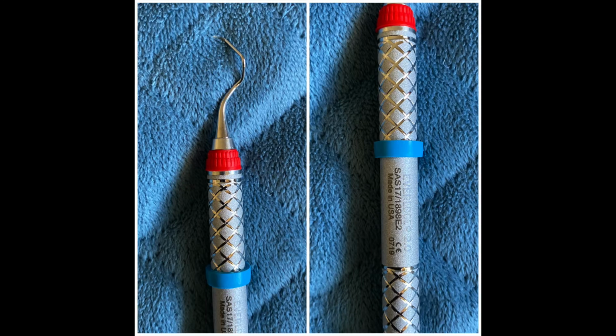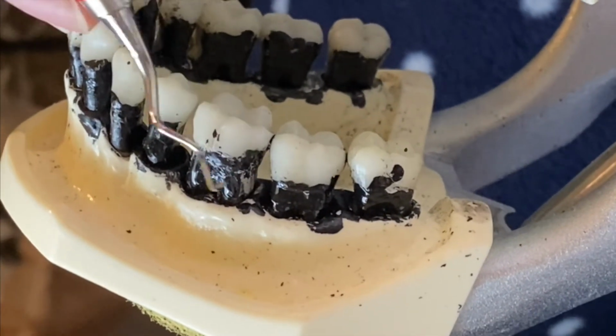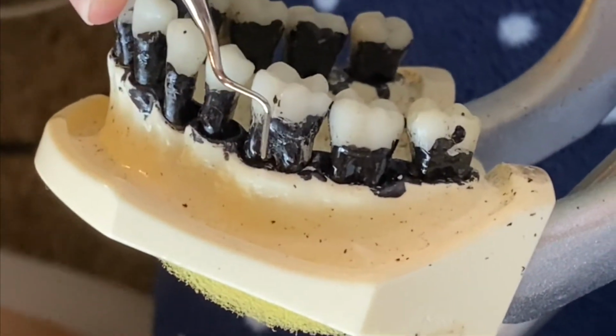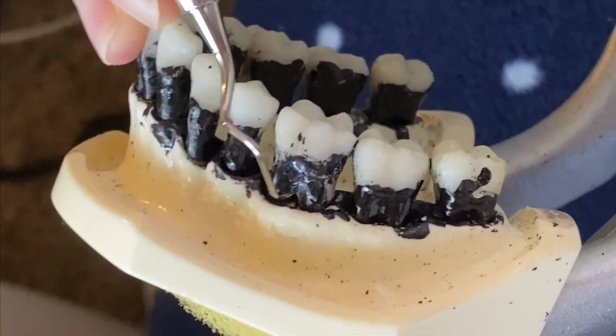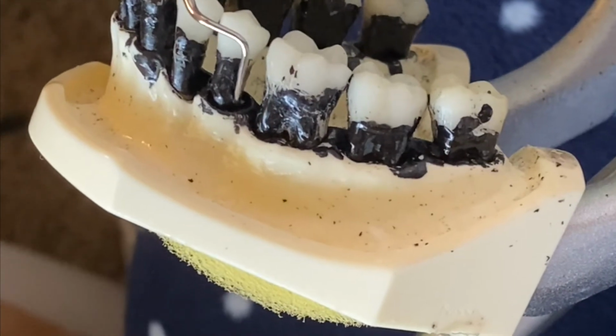Next, we'll be using a 17/18 Mini Gracey, and it's especially helpful in areas of bone loss, and it's used on the distal surfaces of posterior teeth. It's helpful in narrow, deep pockets, along with furcations. Here I am using it on the distal surfaces of the lower left quadrant, and I'll be using that in the furcation as well. When you are debriding a furcation, you want to split it in half, so acting as if you are debriding two separate teeth.